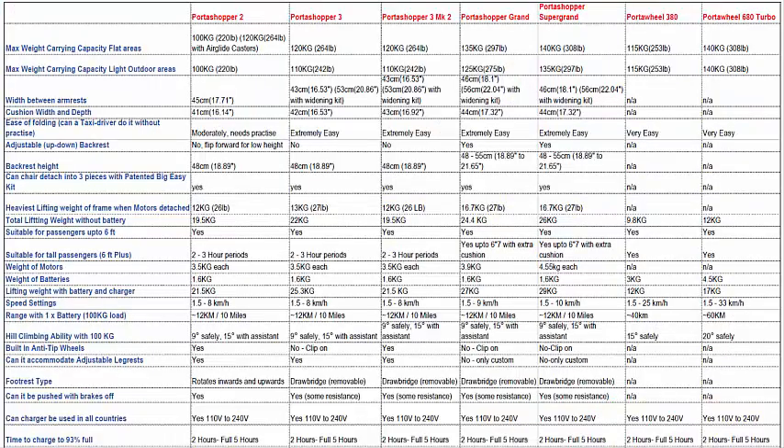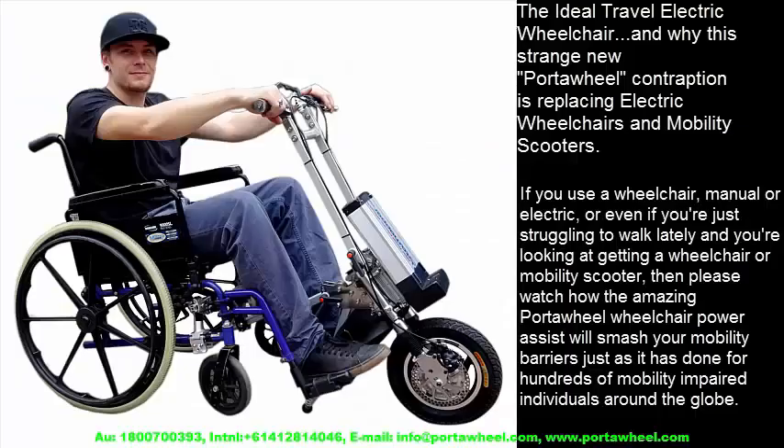Finally, we move on to the PortaWheel 680 Turbo — the 680 denoting the wattage of the brushless hub motor. As the name indicates, the 680 is much more powerful.